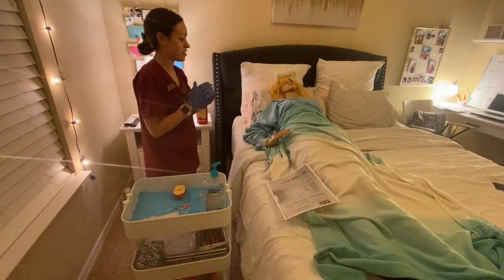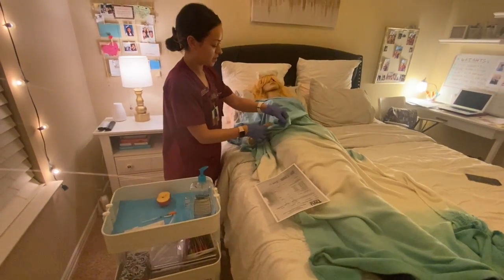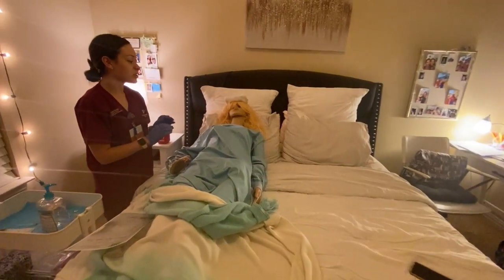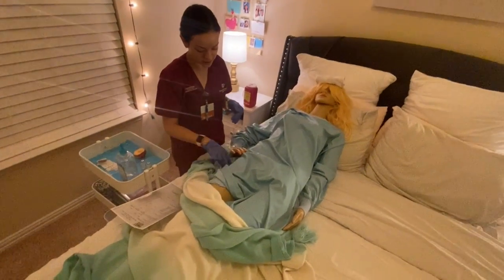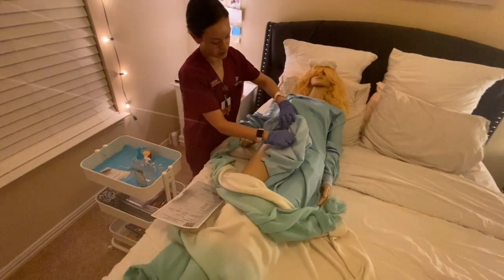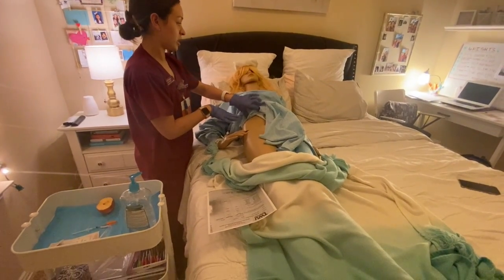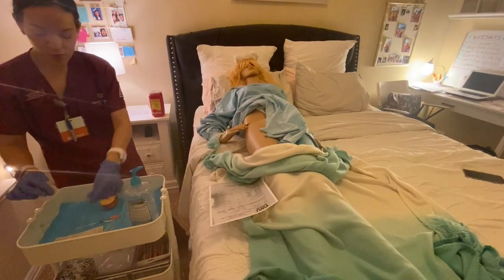And now I'm just going to remove your blanket, and just going to roll that down. And I'm going to just expose the area that is needing to be exposed, okay? So I'm just going to show off her abdomen, since that is the area where we will be injecting your insulin in today. And I'm just going to get an alcohol wipe.